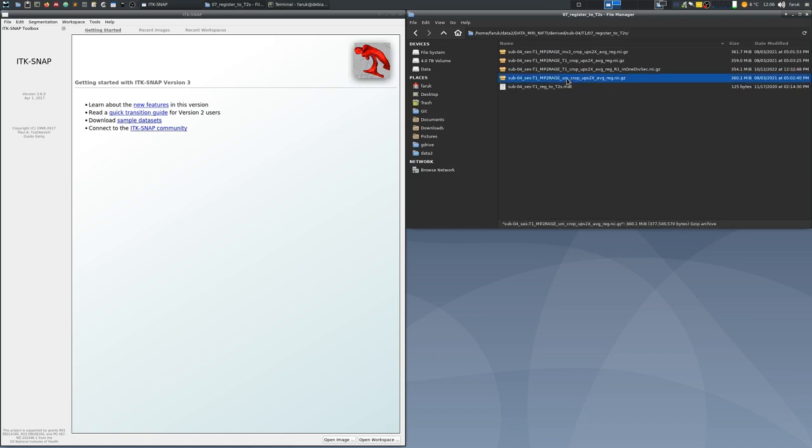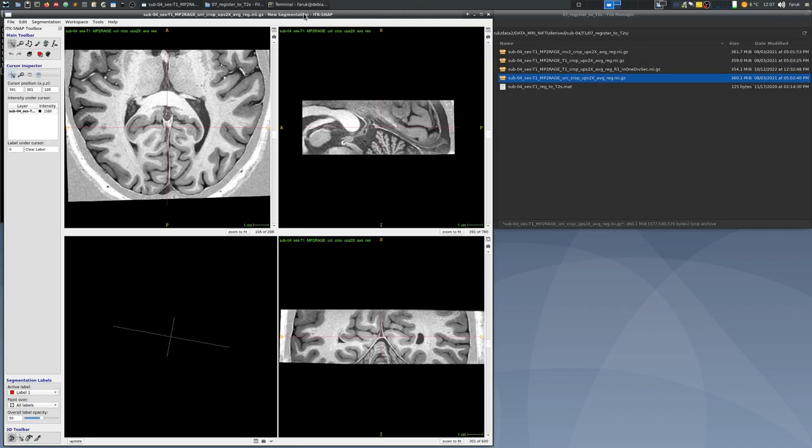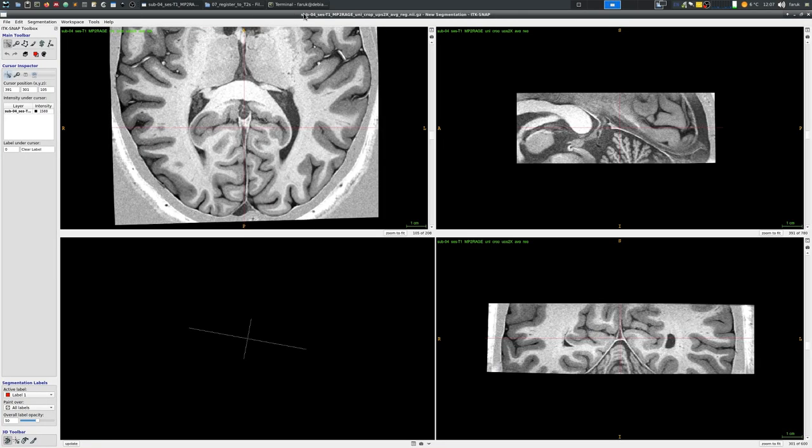This data set is acquired at the 7T Magnetic Resonance Imaging Scanner using MP2Rage protocol and what you are now looking at is the Uni contrast that is similar to T1 weighted contrast.